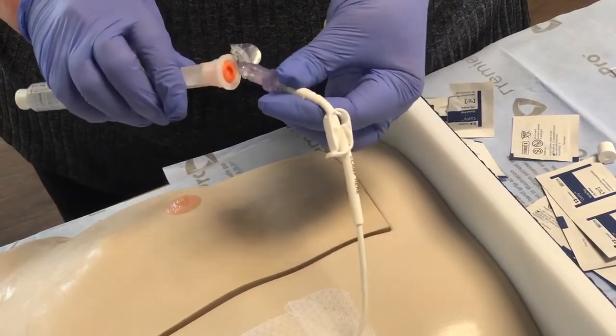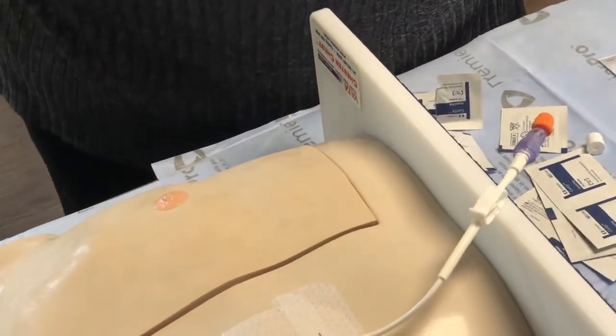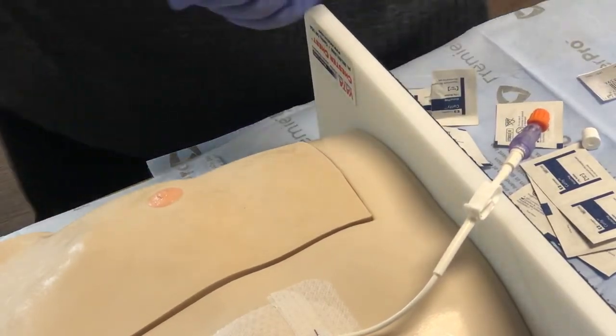Transfer blood into your specimen tubes. Label your specimen with date, time, and initial. Discard used samples, remove gloves, and wash hands.